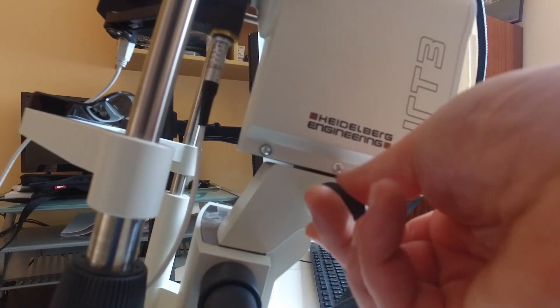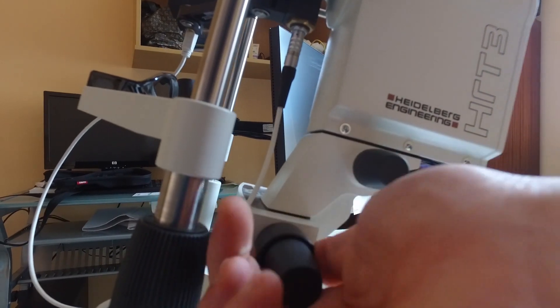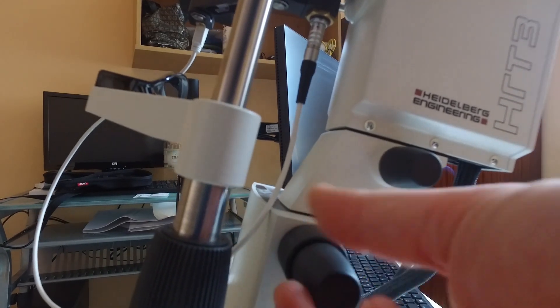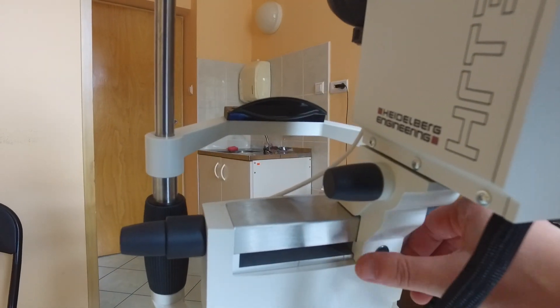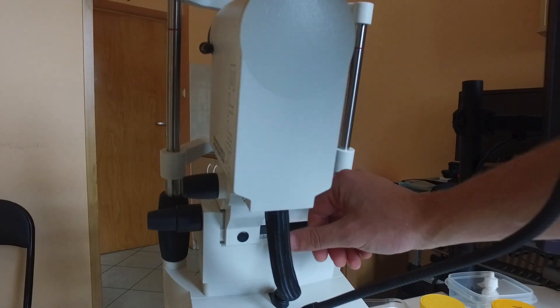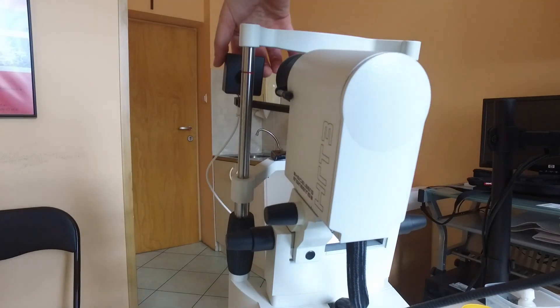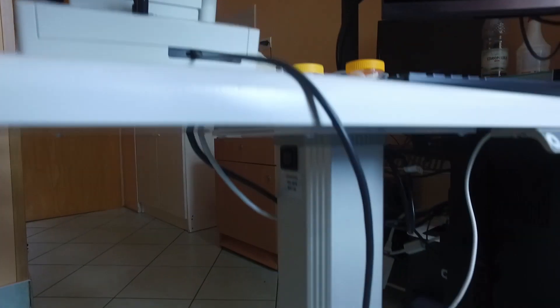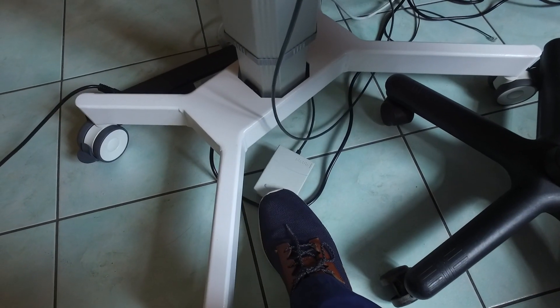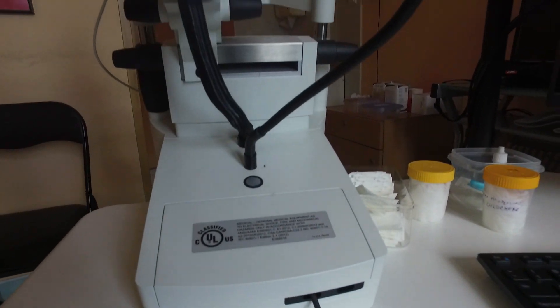This is how you manually adjust focus, this is how you move back and front, this is how you move right to left, and this is how you move up and down. There is also a faster way to move right to left if you need to change the eye being scanned — you do it by clicking on this black button and then naturally adjusting the external camera accordingly. You take images by clicking a button, but there is also an easier way using a footswitch, which is highly useful because you need both hands to operate the machine.